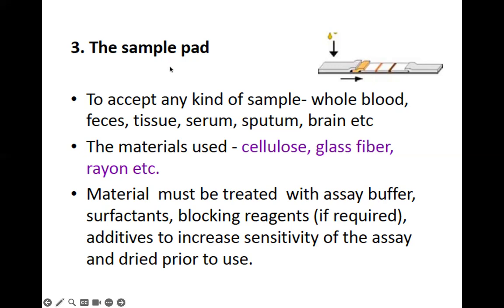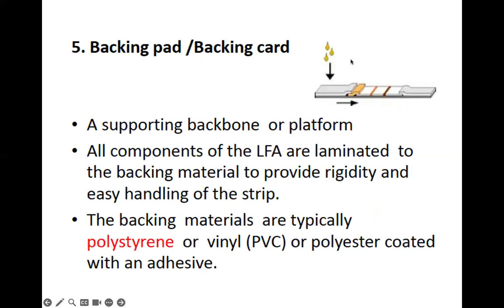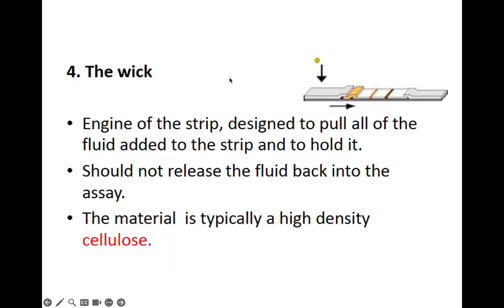Right. Okay. So the wicking pad, I think there is no issue on this because it's just towards the end of where everything is pulled. But it should not release the fluid back into the assay because it should be the end. It should be designed to pull all of the fluid added to the strip and to hold it. Should not release the fluid back into the assay.